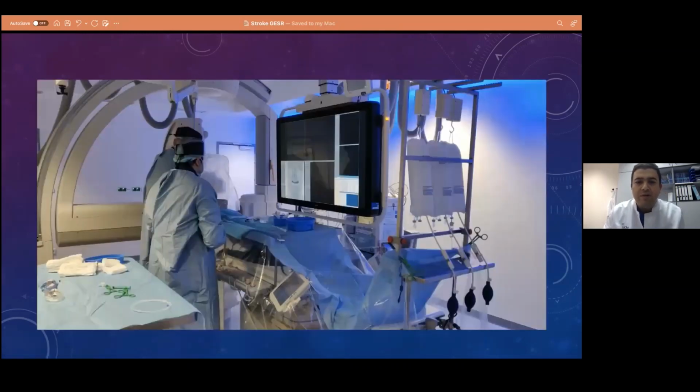And when we go to the angiography suite, we are usually 2 on the table. So one gets things prepared regarding flushing the catheters and gets all air bubbles out of the infusion, and the other starts getting the access.